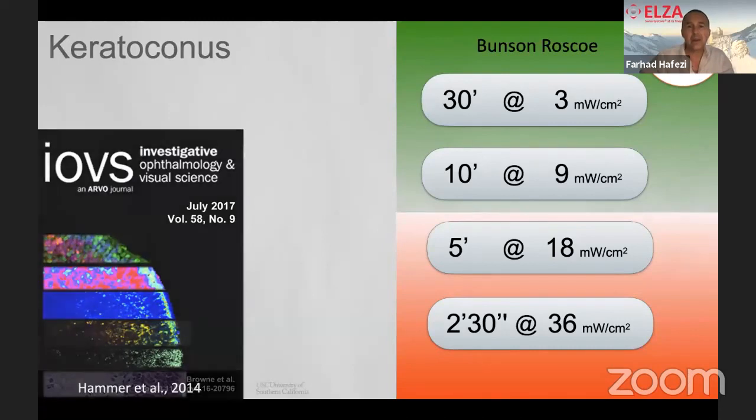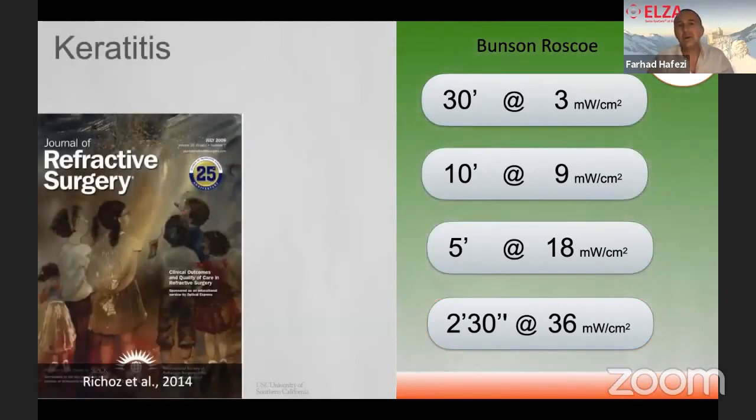And here you can go faster. You can go to 150 seconds, 2.5 minutes with very high intensity without losing efficacy. We published this 6 years ago already. Why? Oxygen independent, partially independent. So at least within this range of intensities, yes, you can go very fast. Let's look at the clinical data. We went really fast and we went into smaller ulcers, and this is where things started looking very different.